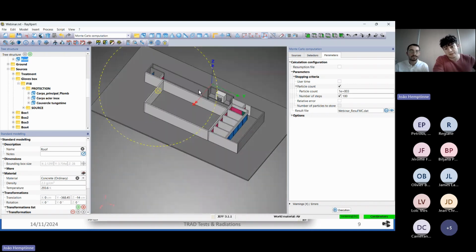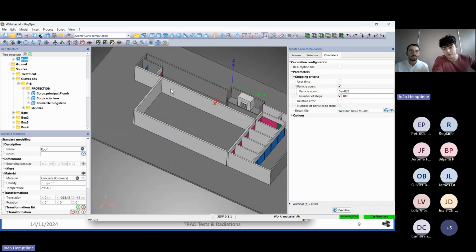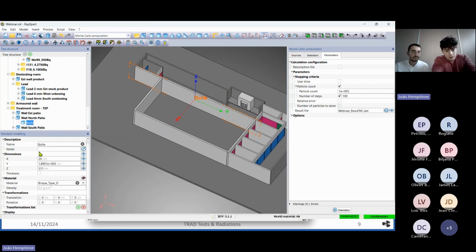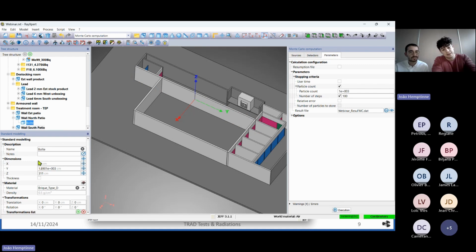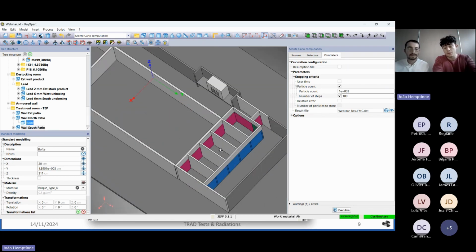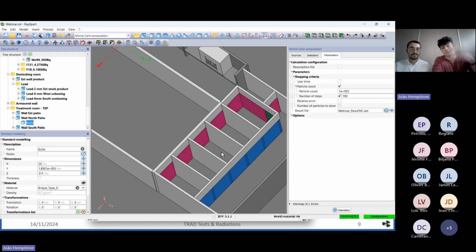So I built this model thanks to basic shapes, like Joao just said before. For example, the walls are just boxes, and you can set here the different dimensions. And we will present you the radioactive source a little bit later. So you can go ahead.